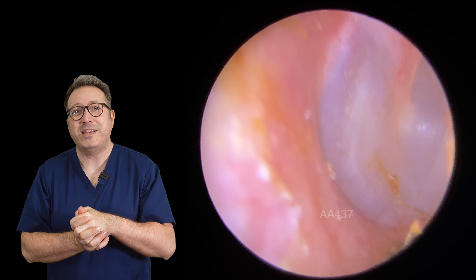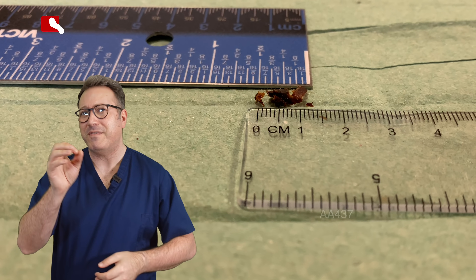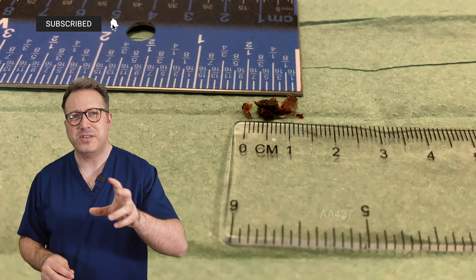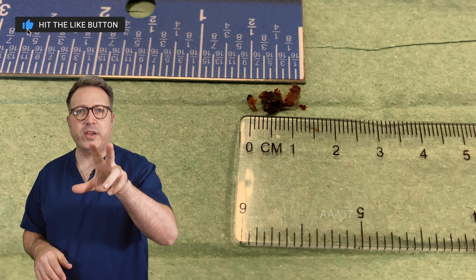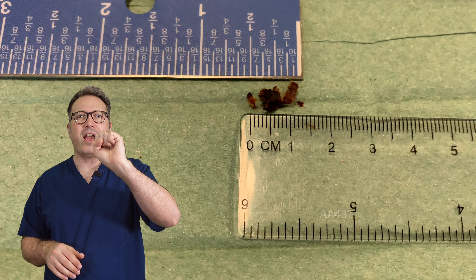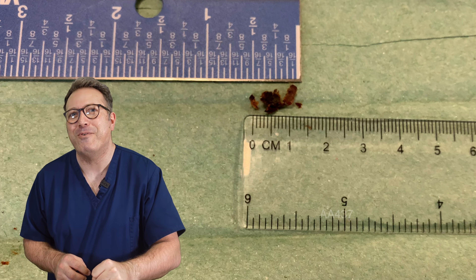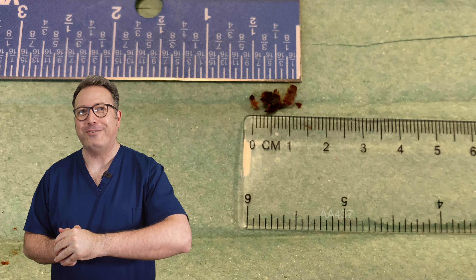If we take a look behind that — the eardrum itself — look how clear that eardrum looks, absolutely fantastic. There is a bit of a lack of light reflex there, so the patient probably has a little bit of dullness to the eardrum and may well have a little reduction in middle ear pressure. So what we've got here is about a centimeter and a half — I'm going to go with just over half an inch, or actually five-eighths of an inch — that's far more accurate.